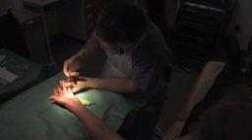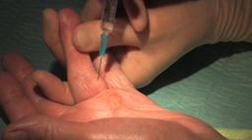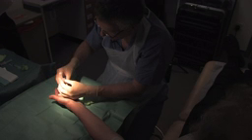Skin wheel anaesthesia is used. It is extremely important to restrict the local anaesthetic injection only to the skin. This ensures that the digital nerves are not anaesthetised, because the patient's perception of nerve irritation is an important indicator of the location of the digital nerves. This in turn helps to avoid digital nerve injury.